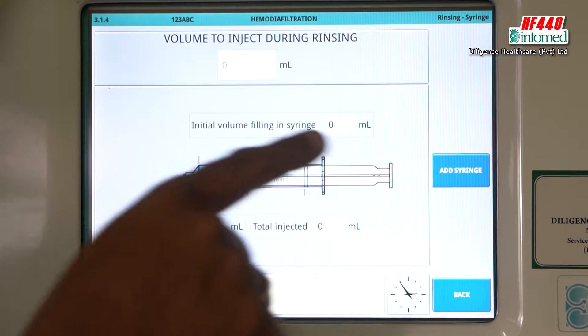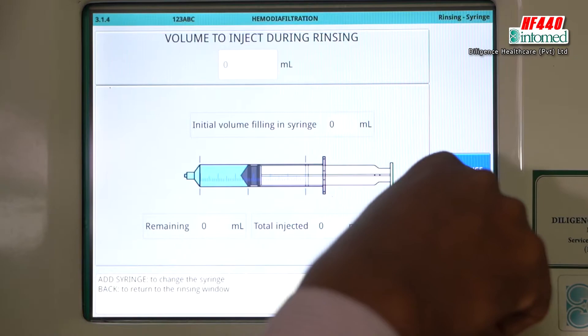Then you can understand, you can locate that particular tube very easily. Then you have to go to the syringe pump, then add syringe.